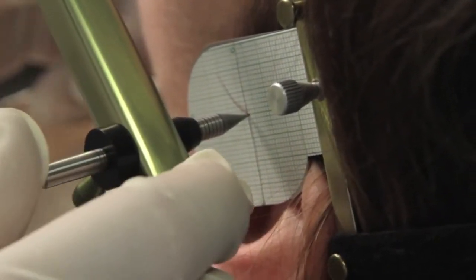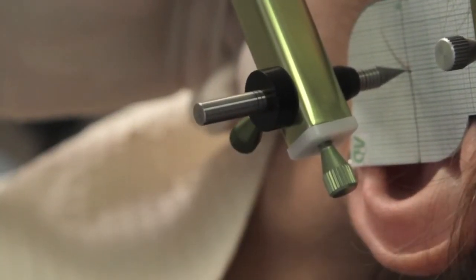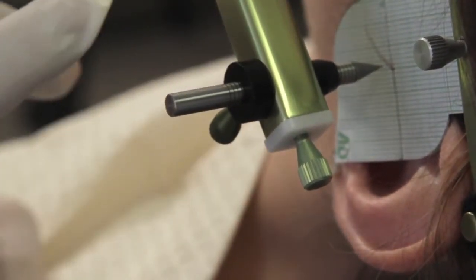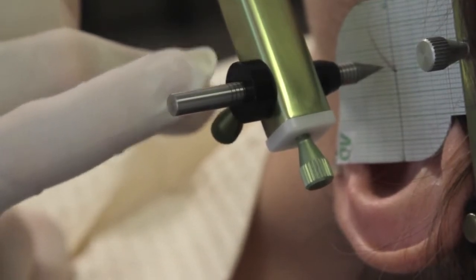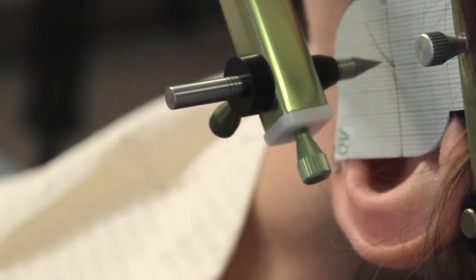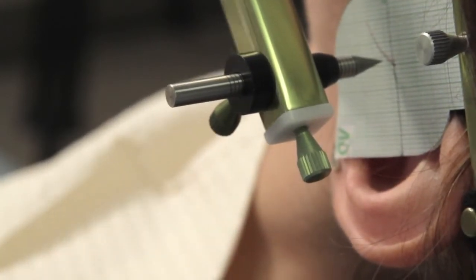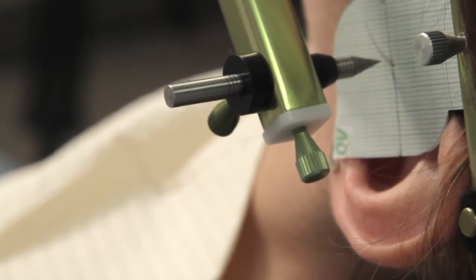We'll try it one more time to demonstrate it. There we go. Move right. Stop. Now, if you count the number of millimeter marks, you can see that we now see 3 millimeter marks. We started where we could see 2. Now we see 3. That means the patient has a 1 millimeter immediate side shift on the left side.